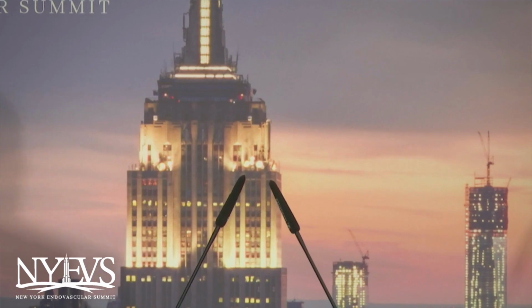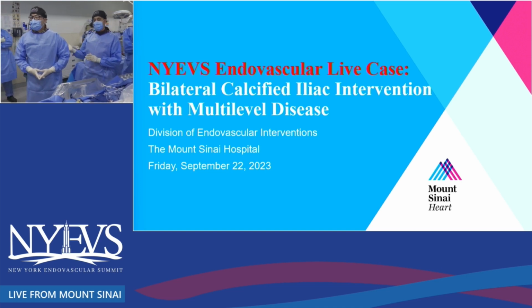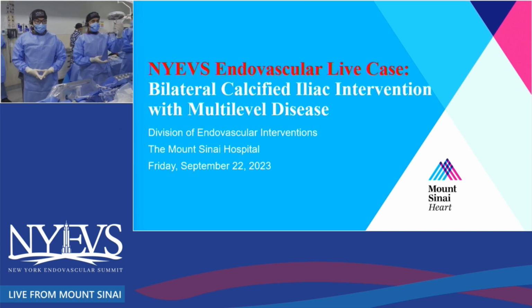Good afternoon, everyone. Thank you to PK for giving me and Karthik the opportunity to do this live case. We're going to present an iliac case, which our fellow is right here, David Song. We have Liz as our nurse, Josh as our tech, and Roby's out here too. We're going to start with the live case presentation, and then we'll show you the pictures.